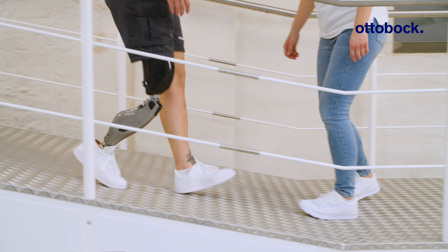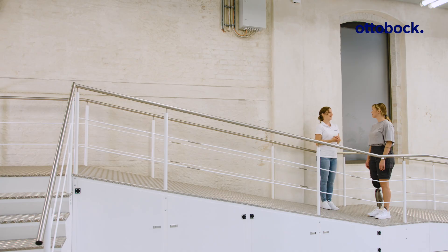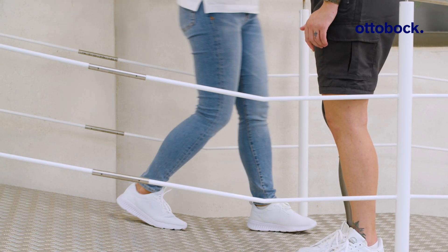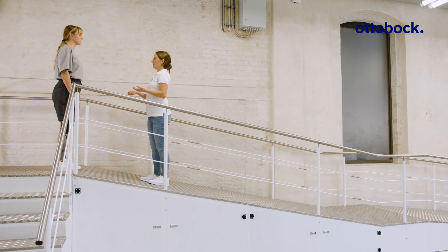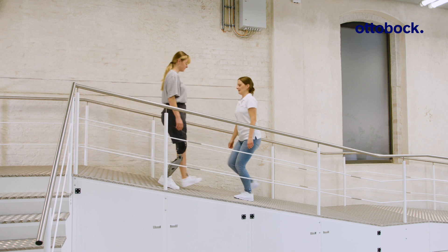When walking downhill on steeper slopes, it is not possible to release stance. Practice using the yielding technique instead, which allows the prosthetic user to walk over the flexed knee joint. The new early and late stance phase support functions enable more controlled stance phase flexion, as well as slower and more controlled walking on ramps.